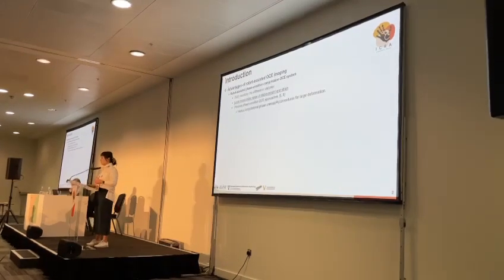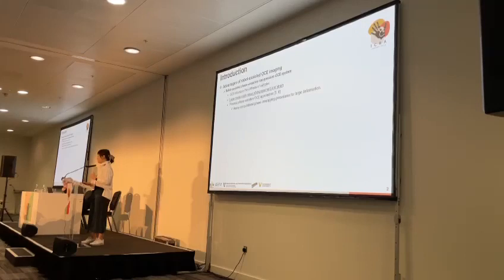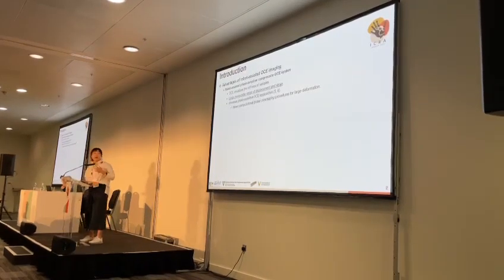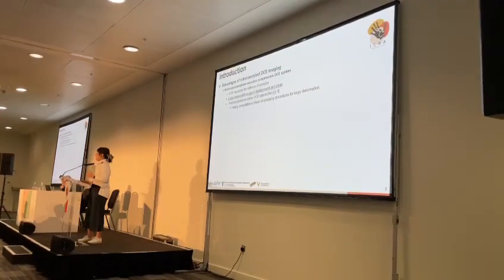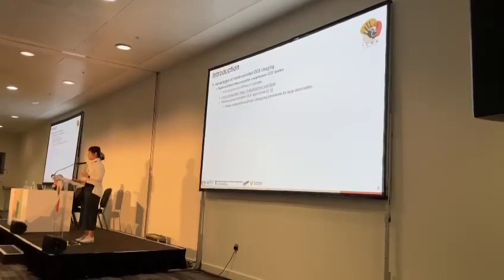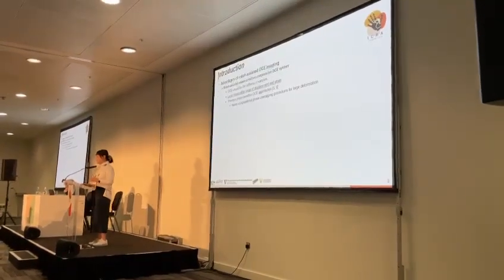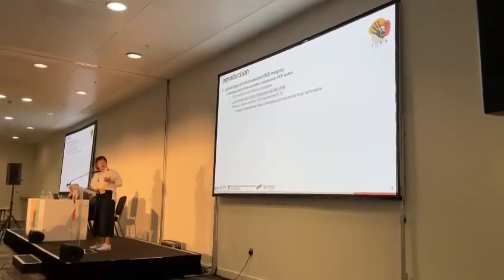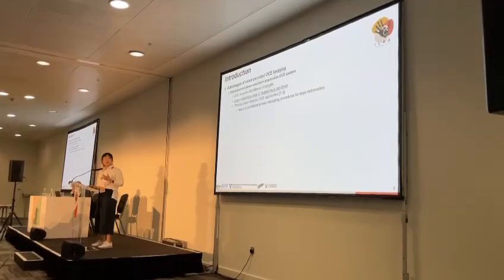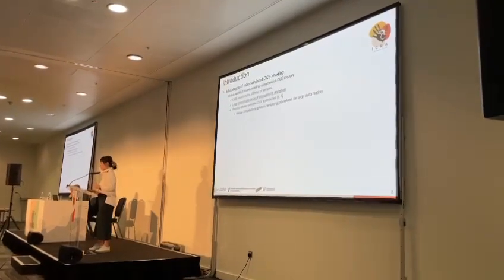OCE visualizes the stiffness of a sample based on optical coherence tomography imaging. Compression OCE is relatively simple and can estimate an extensive range of displacement and strain. The phase-based OCE requires a heavy computation phase unwrapping procedure for calculating large deformation.